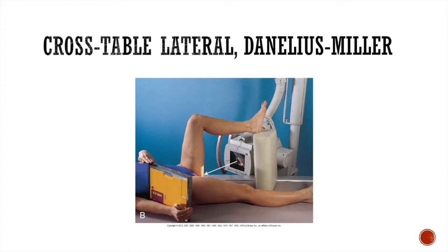femoral neck. You want to collimate to about 10 by 12 inches or less, and be sure to properly mark the correct side of the hip. But make sure to not put it in the anatomy. This can be kind of difficult. You want to follow the technique chart and select tabletop setting, and make sure to shield the abdomen and chest, and you want to take the exposure on suspended respiration.